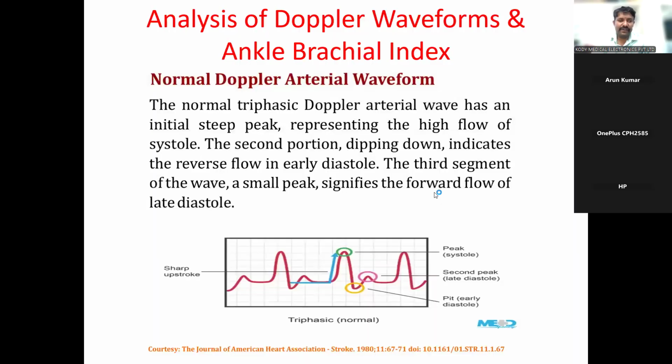Okay. Here we can see a sharp upstroke. That is the first phase. The second phase is the early diastole, marked in yellow and rose color. The late diastole is the second peak. This is a triphasic waveform, which we can see in our Doppler.